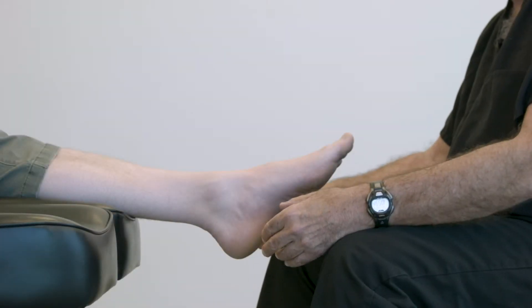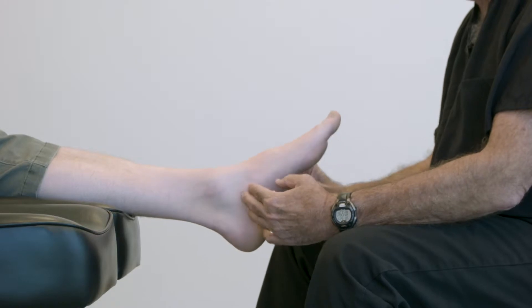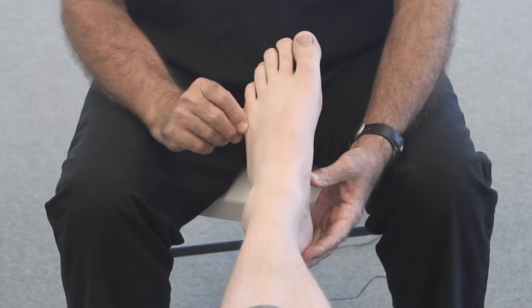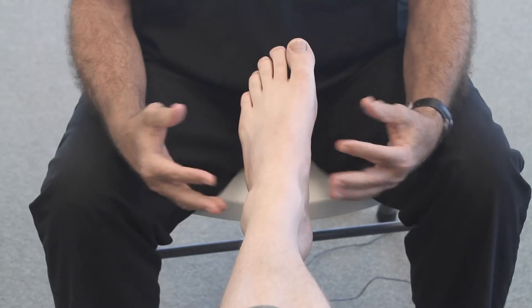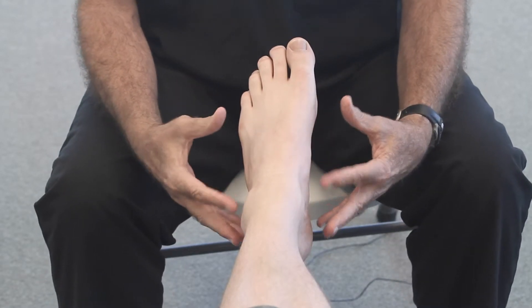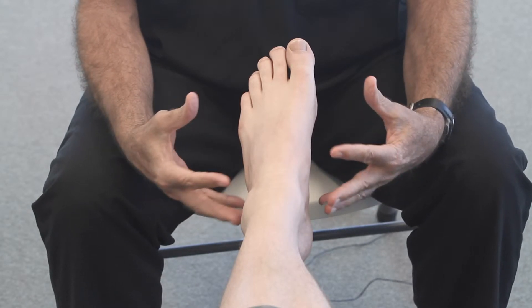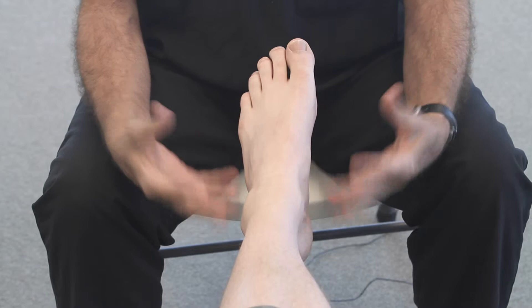Before taking the cast or scan for the custom foot orthotic or the Ritchie brace, I find it helpful to demonstrate to the patient what you're going to try to do with the positioning, because it allows them to appreciate the science behind the orthosis or the brace.